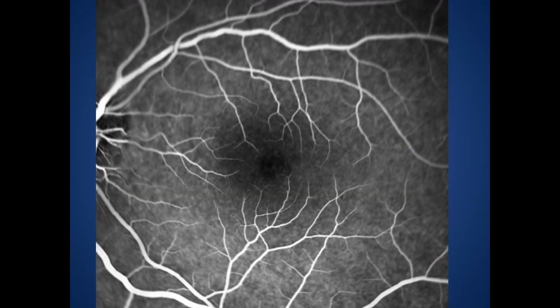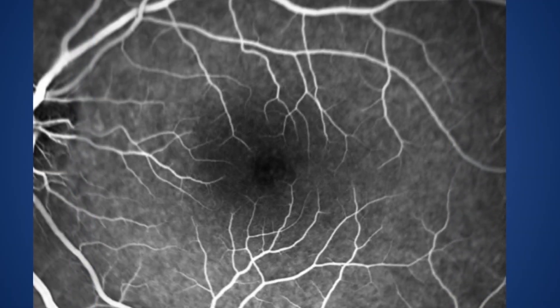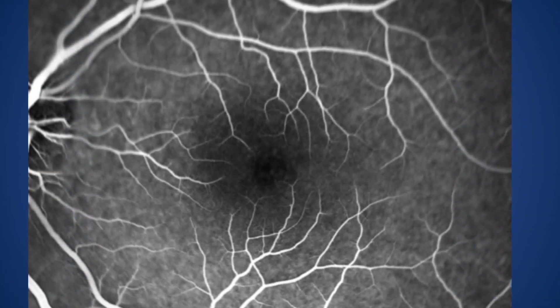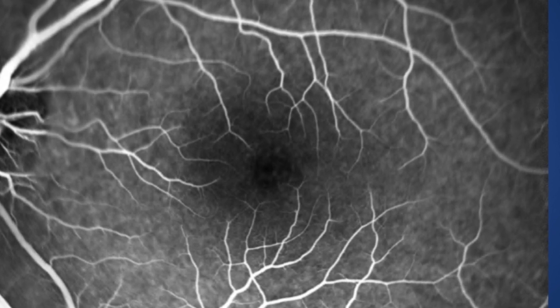This is a frame of the fluorescein angiogram of the arteriovenous phase of the left eye, showing areas of central hypofluorescence surrounded by areas of mild hyperfluorescence. This is a close-up picture of the fluorescein angiogram.